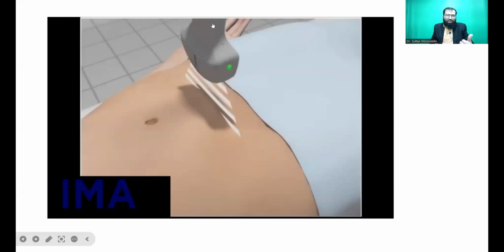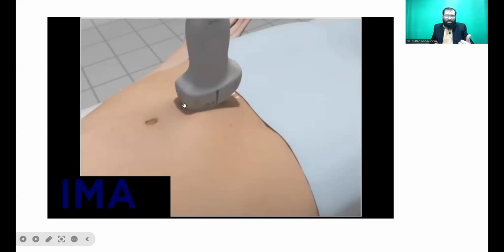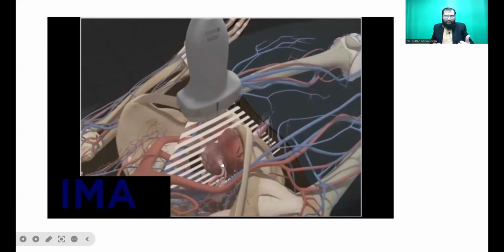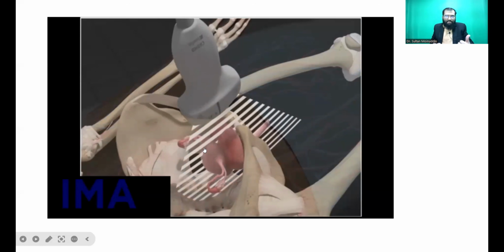They were longitudinal. So now this is the ultrasound probe. This is the marker, the green colored. Yeah. So now you are able to see this is how you move the probe. The marker faces towards the head end of the patient. Now this is how you take a mid-sag image. Okay. So now this is the orientation of anatomy. Look here, this is the bladder, this is the uterus.